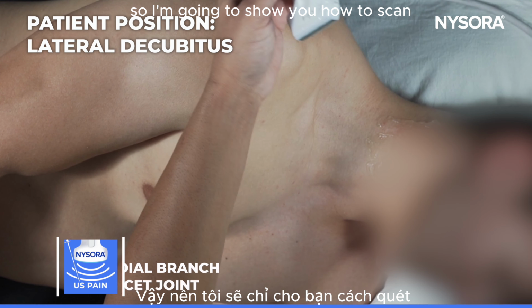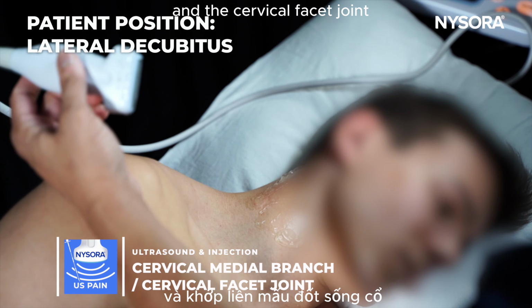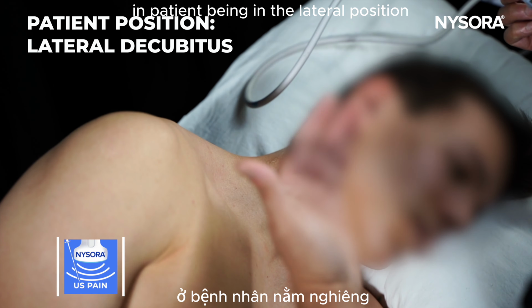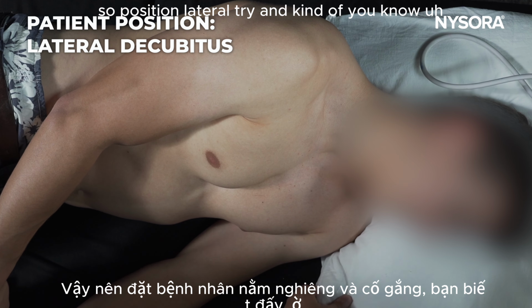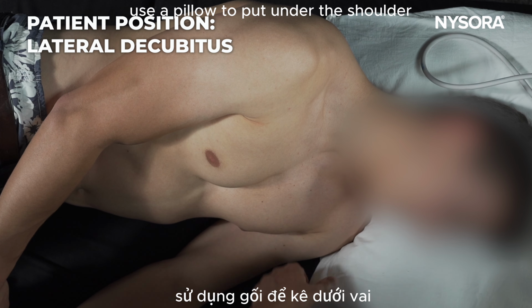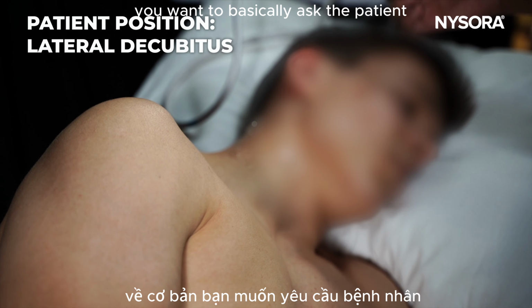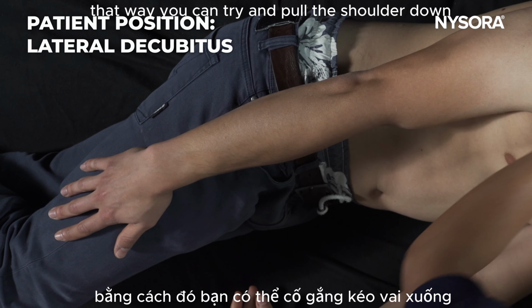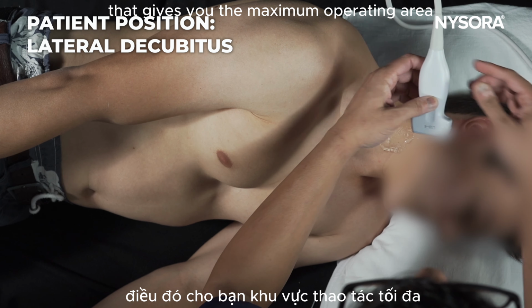So I'm going to show you how to scan for the cervical facet joint injection and the cervical facet joint medial branch block with the patient in the lateral position. So position lateral, and try to use a pillow under the shoulder. If the patient has a short neck, ask the patient to reach for the knee. That way you can pull the shoulder down, which gives you the maximum operating area.